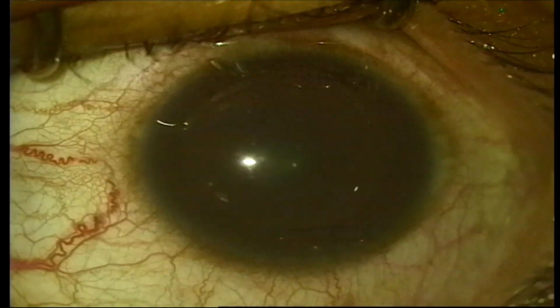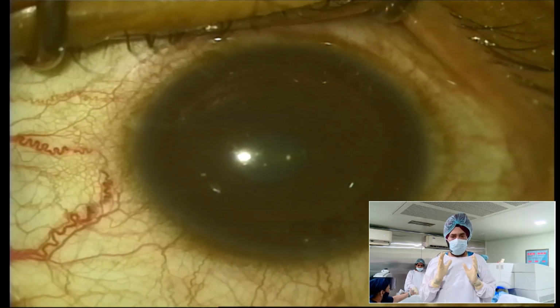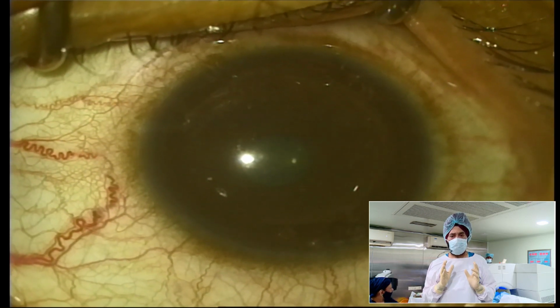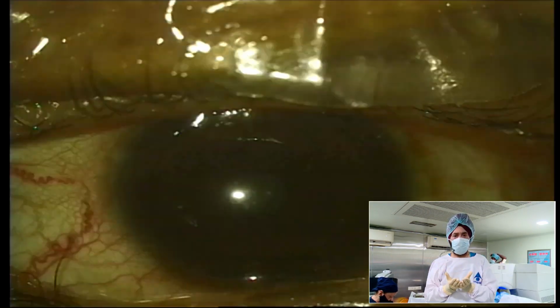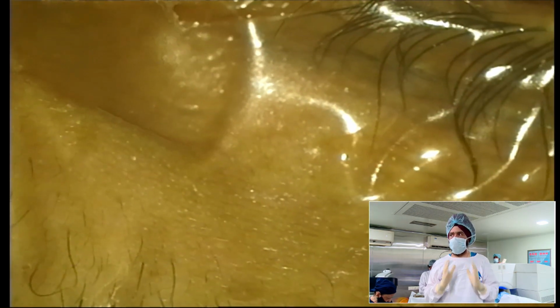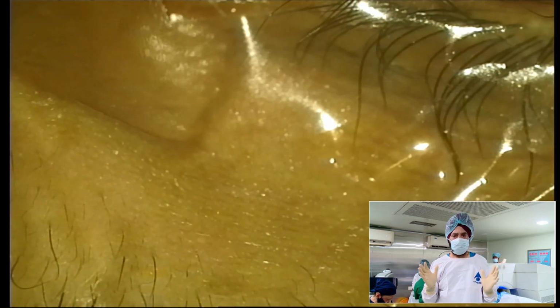Okay, so the tips that you have to do is that the first thing is that the patient should not be apprehensive. The anesthetic should be proper, and the patient has to be told to look at a blinking green light. Often when the green light disappears, when the first pass is coming, the patient starts to search for the green light. I didn't televise that, but the patient was told beforehand that when the green light disappears, the patient should not bother and should not start searching for the green light.